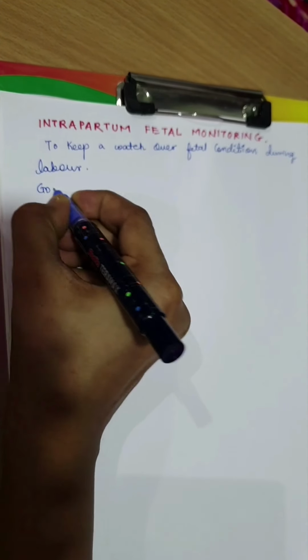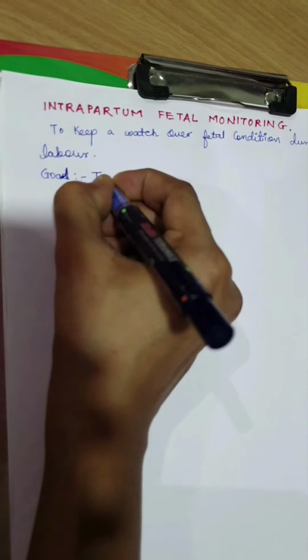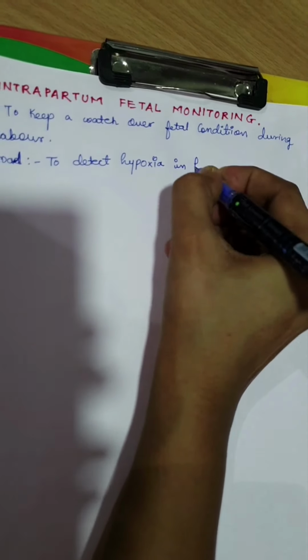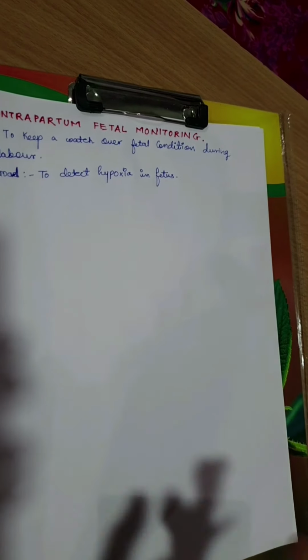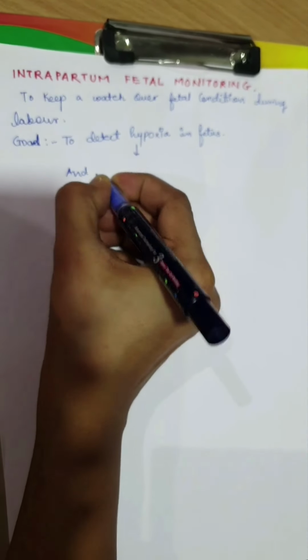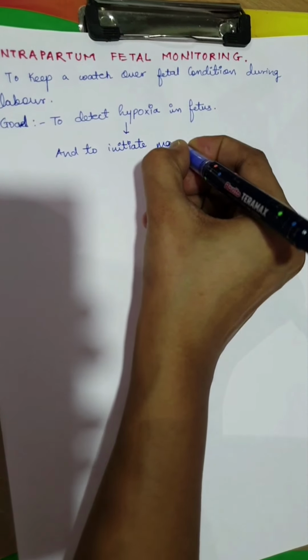Now what is the goal? Why should we do that? The aim of this fetal monitoring is just to detect the hypoxia of the fetus, so that if the fetus is suffering through the hypoxic condition, we can initiate management as soon as possible.